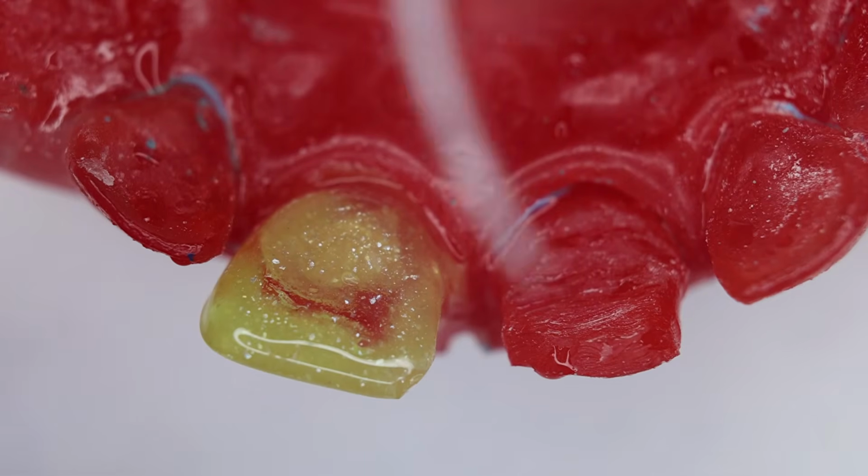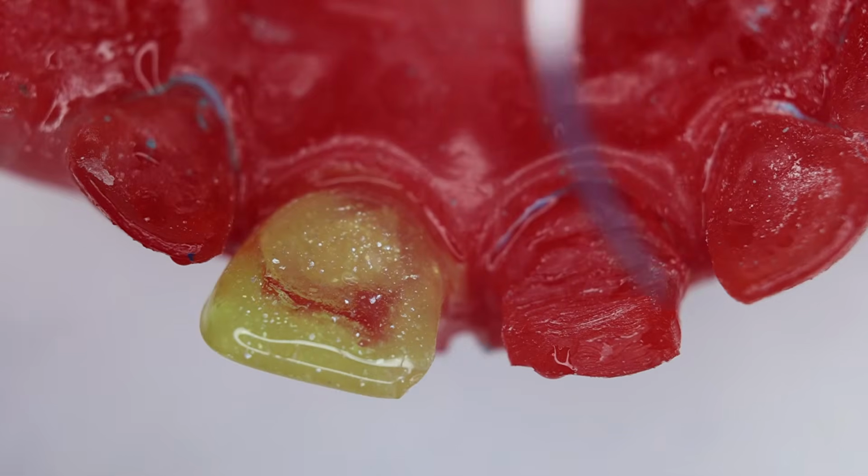When patients come, they usually have more incisors or all the incisors involved due to caries. So the situation is that we need to plan the strip crowns not just for a single tooth, but in most cases we need to plan multiple teeth for restoring them with strip crowns.